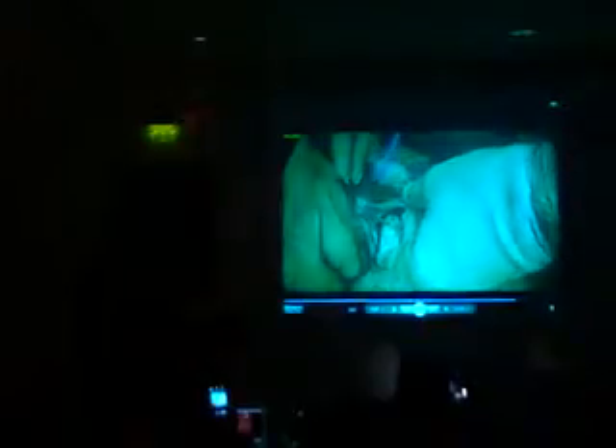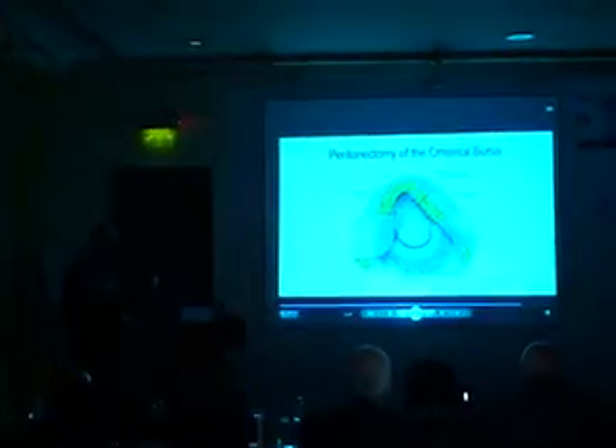People just don't look under there, and unfortunately later on the patient comes back with obstruction of the hepatic duct — so that's the tissue from underneath the porta hepatis. This is a rather large lymphatic going out of the porta hepatis and into the hepatogastric ligament. This is very hot electrosurgical dissection with an absence of any hemorrhage as these structures are transected. A final step is to elevate the left caudate lobe.